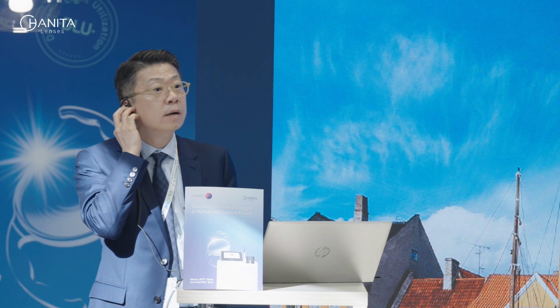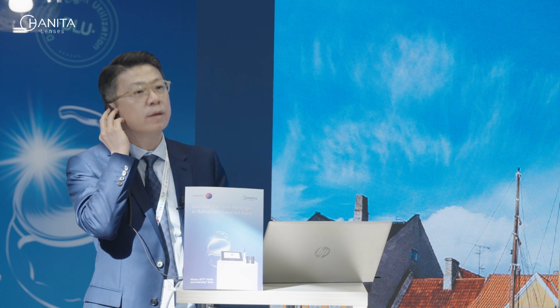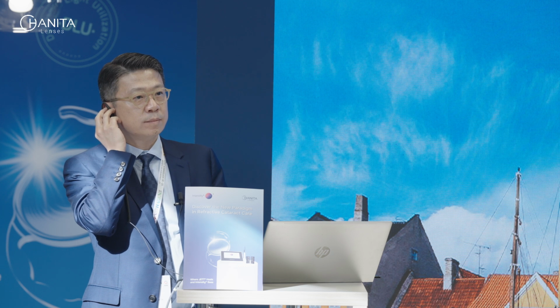Wonderful presentation, Professor. Thank you. From your defocus curve, I think the biggest advantage is that the Intensity at minus 1.0 diopter allows me to shift my refractive result, and I'll show that in the next class. But I think that's where it stands apart from the other lenses. What do you think?